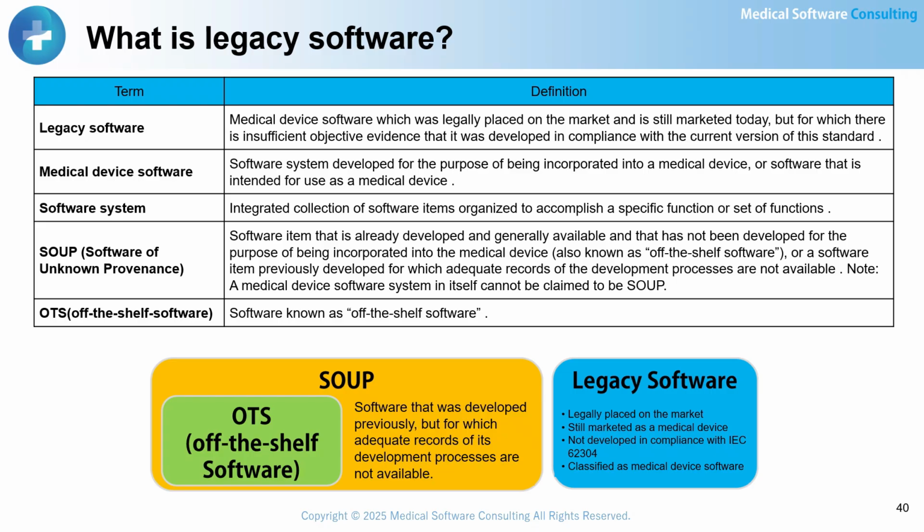This means software that has already been developed and is generally available, but was not created specifically for incorporation into a medical device, often known as off-the-shelf software or OTS. It can also mean previously developed software items for which adequate records of the development process are not available. OTS, or off-the-shelf software, is categorized as a type of SOUP. In the next slide, we will explain the IEC 62304 requirements that apply to legacy software.